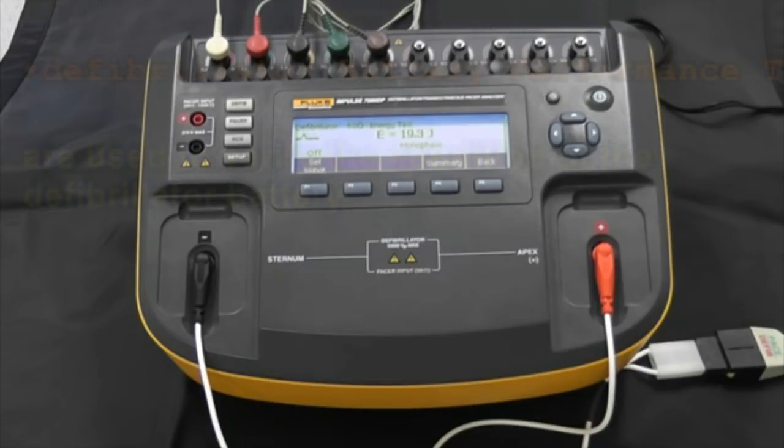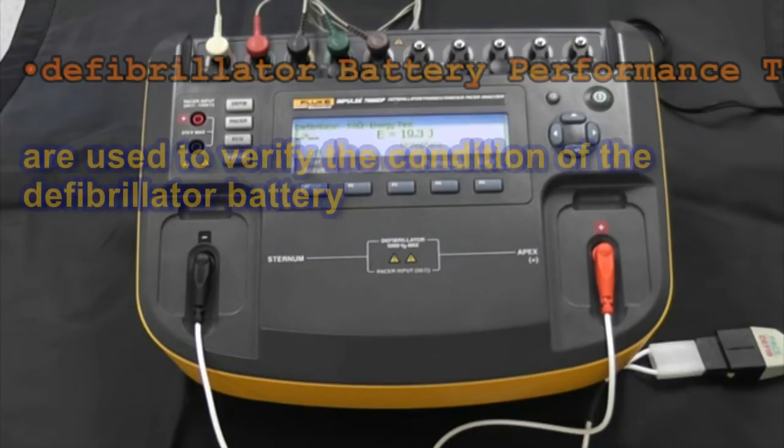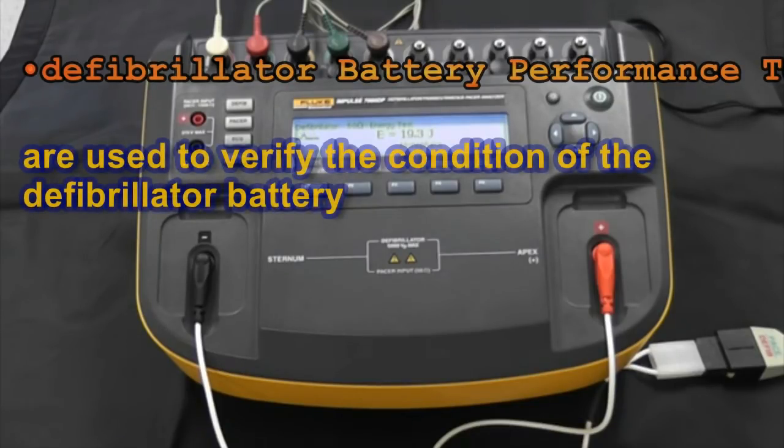If it was a more modern defibrillator or an AED it would have shown biphasic. One of the things that's important when we do defib energy tests is to actually visualize and see that wave pattern. On the back of this unit are the oscilloscope outputs we can use to see what that wave pattern was. We also have a delayed ECG output so we can see the ECG signal that we're actually delivering to the defib, and a USB port where we can control this from software on a computer.